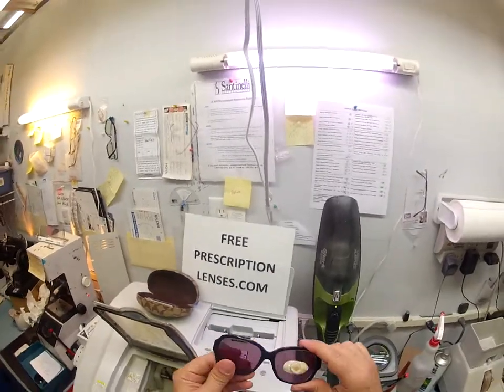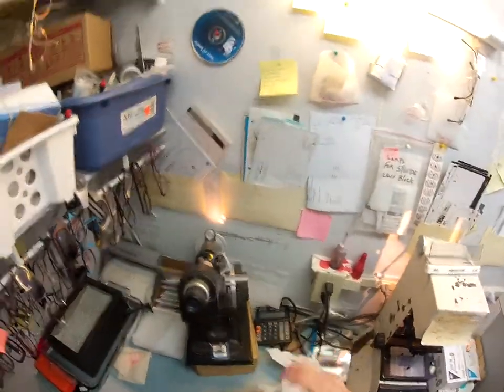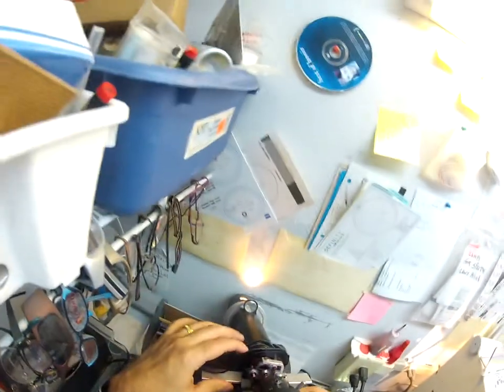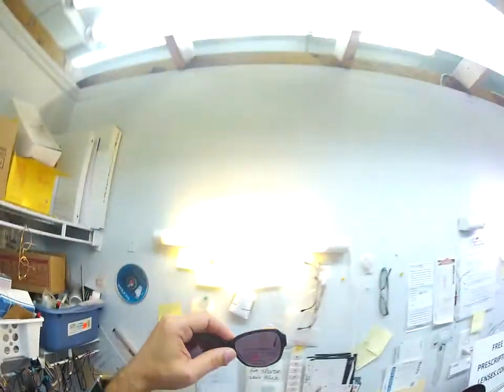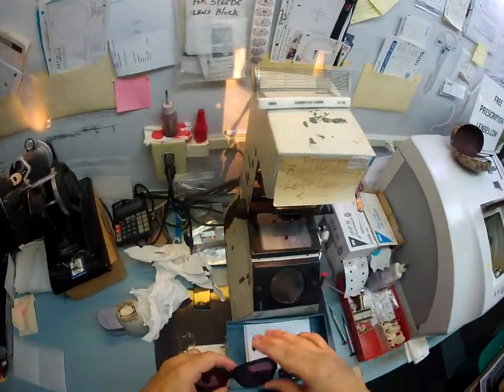So, okay, your left lens is snapped in. I'm going to take this block off. Is my red dot still there? No, I'm holding it up to the light. That's how I can see. So let me put this back in here, test the power. I should be getting minus 150 sphere, you have no astigmatism. Let me darken that red dot, and hopefully you can see all this if my camera is good enough.